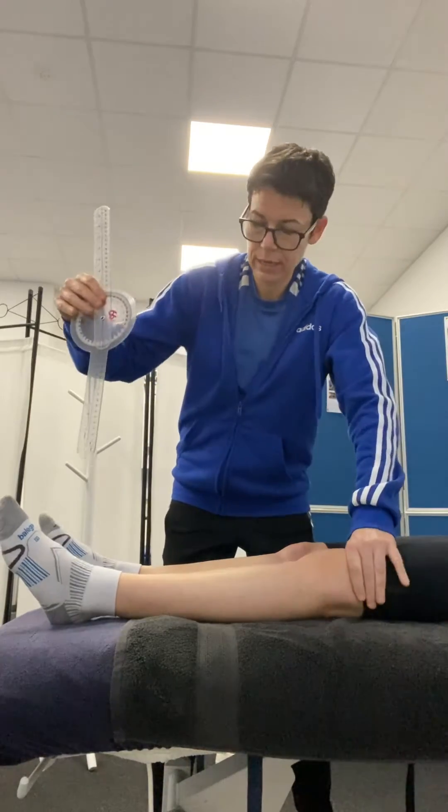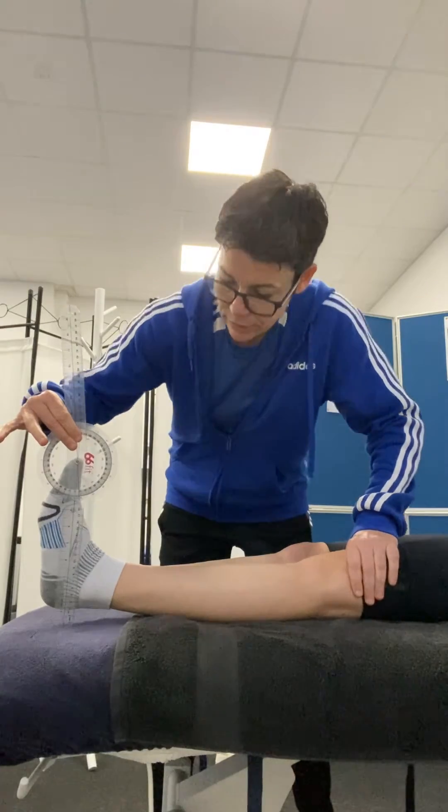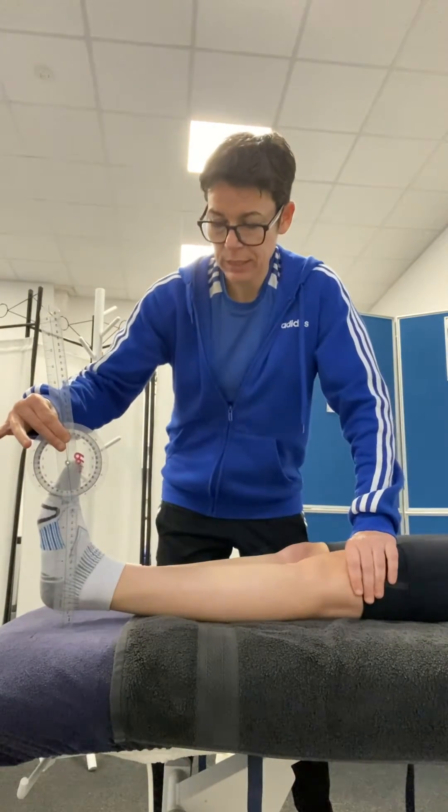We just do that again. I can place the goniometer on the couch and then read it off in centimetres, which is around three centimetres there.